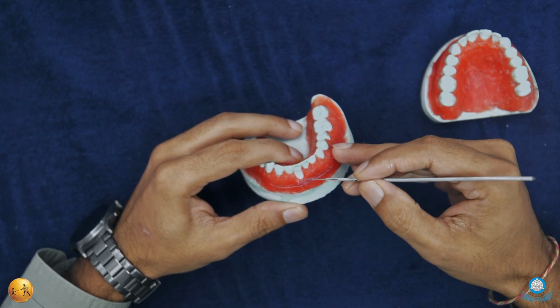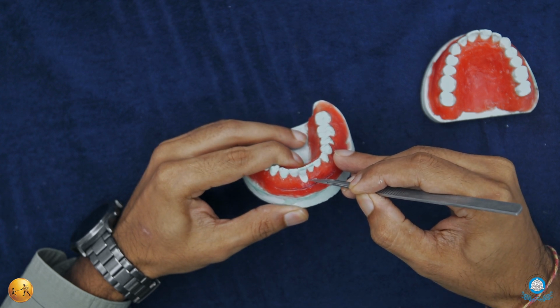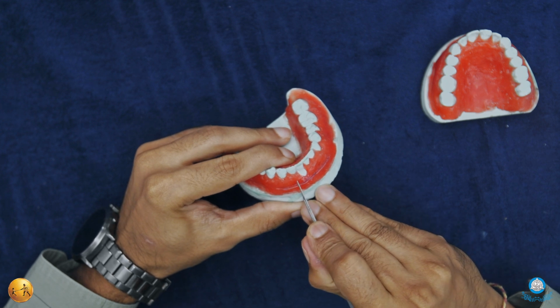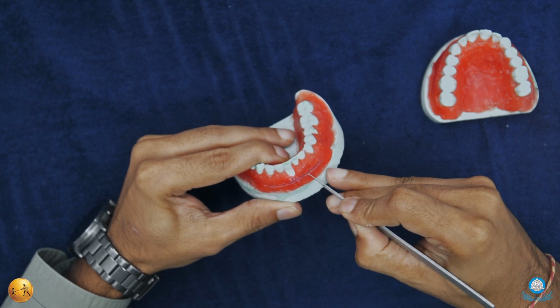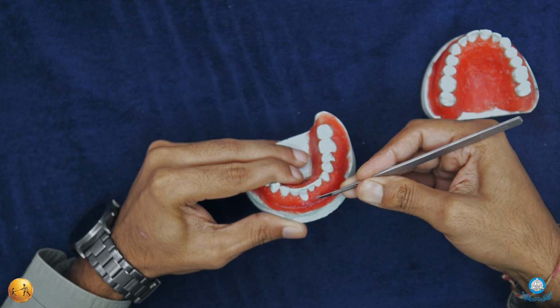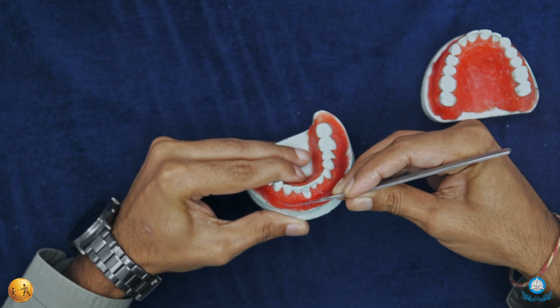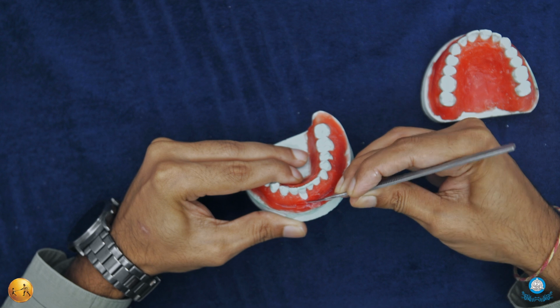Now that involves using a blade, most commonly the 15 number blade, where a horizontal incision is extended on either sides of the recession, followed by vertical incisions which diverge and cross the mucogingival junction, and a partial thickness flap, that is some portion of epithelium and the connective tissue, is removed so that a clear epithelial bed, a clear connective tissue bed is present to receive the free gingival graft that will be obtained from the palate.